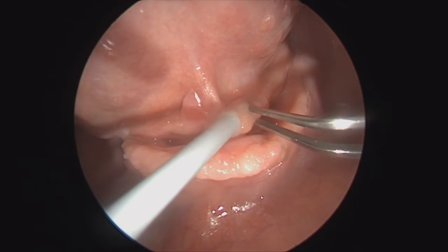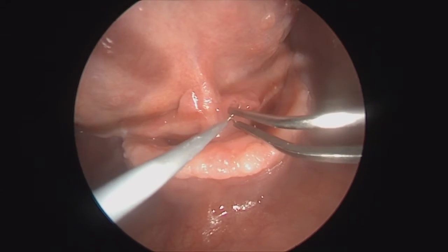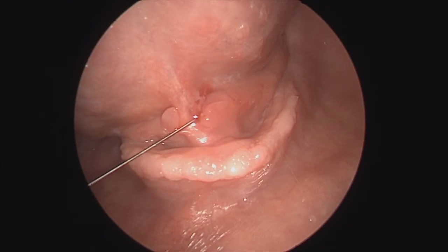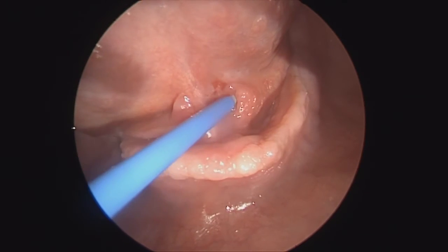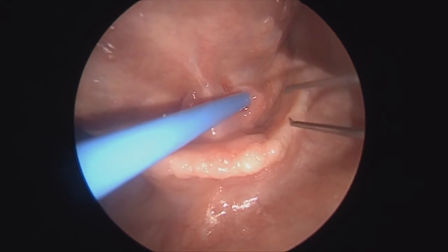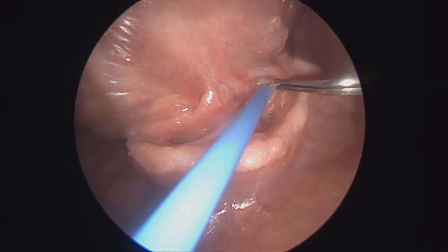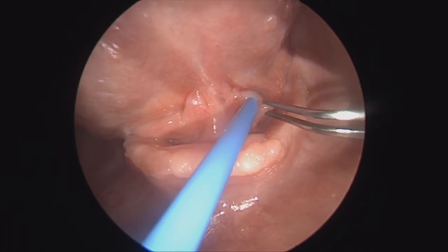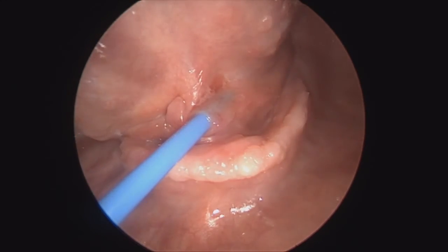It's also important to note that in published studies, 6% of salivary ducts are unable to be cannulated. This is an important point for preoperative counseling of the patient. And then if one is electing to use the camera sheath, you can place the sheath here, as seen with the blue sheath, and then the camera can go in and out while the sheath remains in place. I often like to not use the sheath and simply put the camera in and out of the papilla, as it's easily visualized at this point, and the sheath requires one extra element that can become misaligned and make it a bit more challenging.